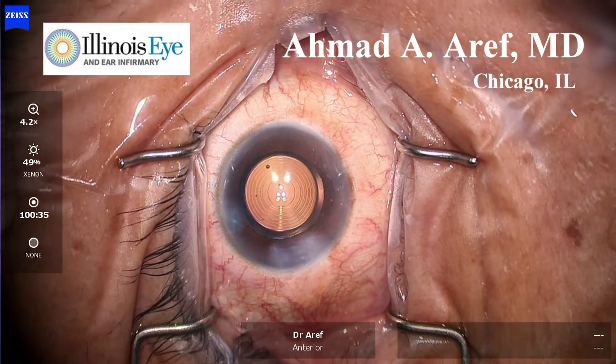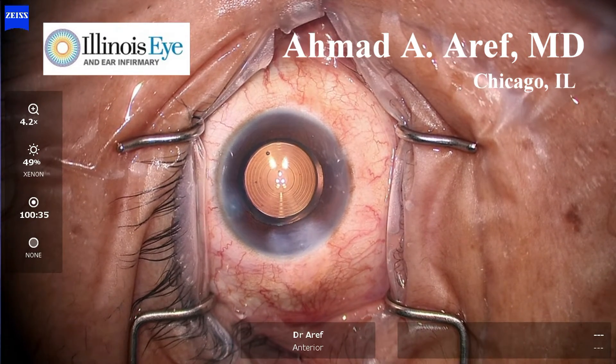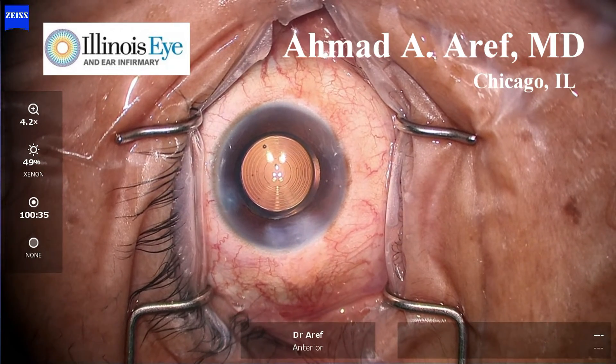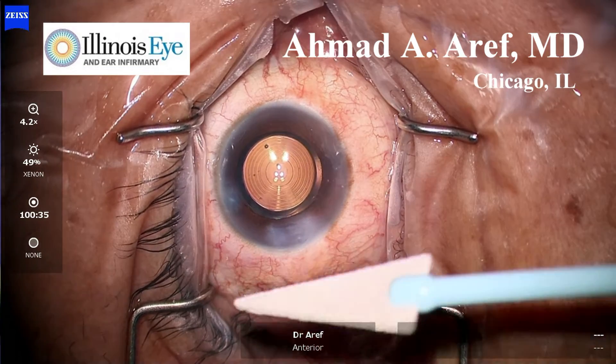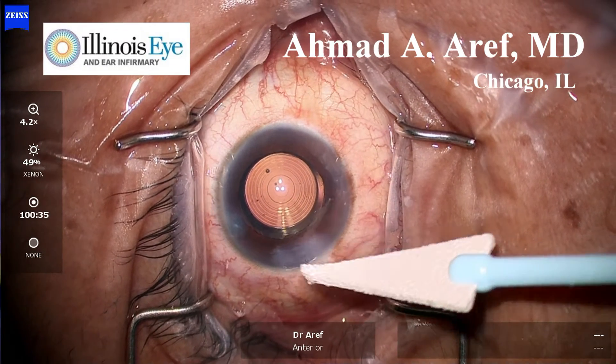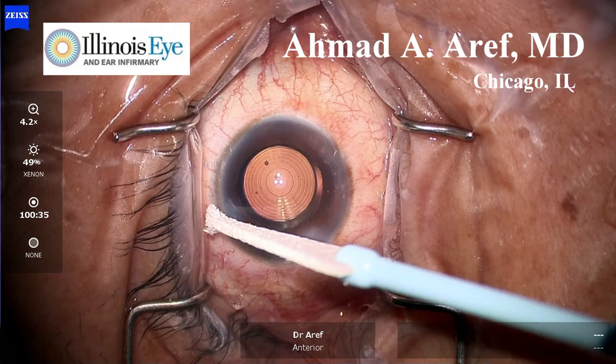Diffractive rings within the lens allow for a continuous range of vision at near, intermediate, and distance. Proprietary technology allows for the correction of chromatic aberrations in order to give the best contrast at each of these distances.